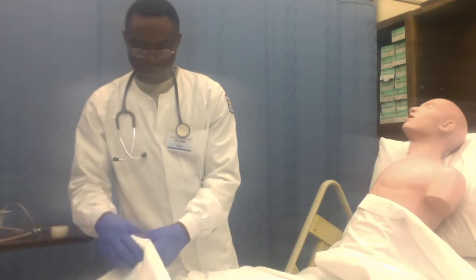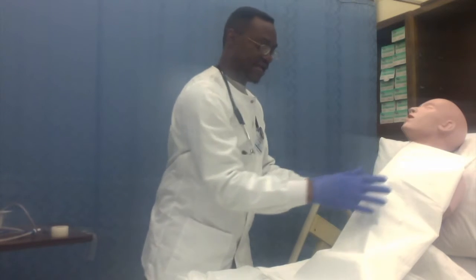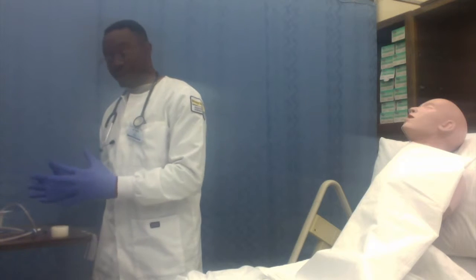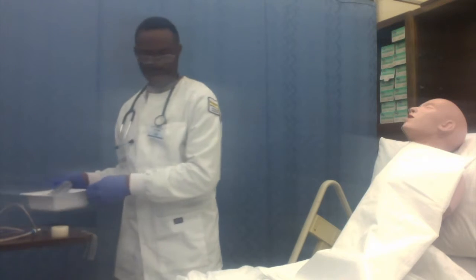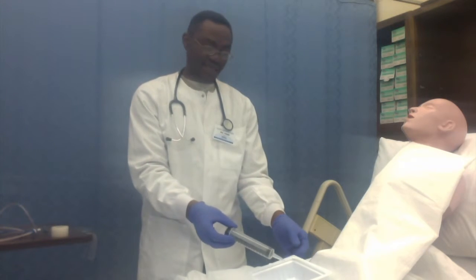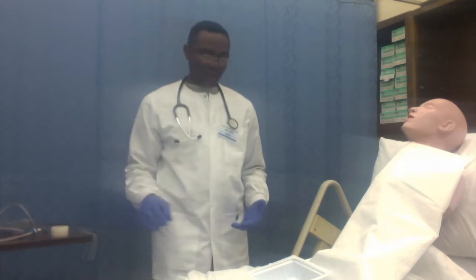I will now treat my patient with a bath towel to make sure that if the procedure gets messy, it will be under control. Having done this, I will bring my material or equipment together and place an emesis basin somewhere by the patient in case he needs to throw up. I will also place a pH strip so that I can find out if my tube has been inserted in the gastric region.